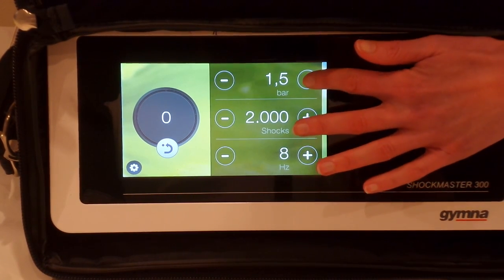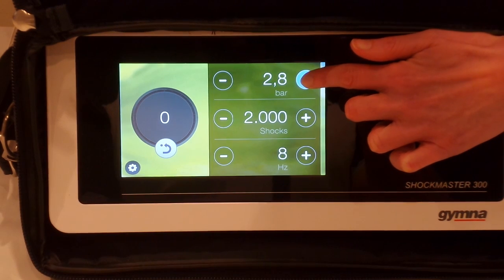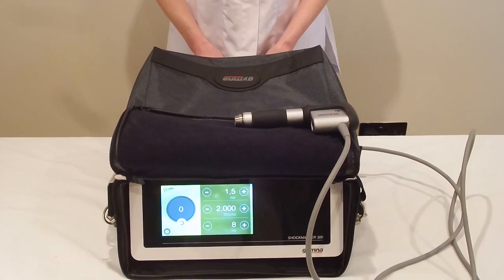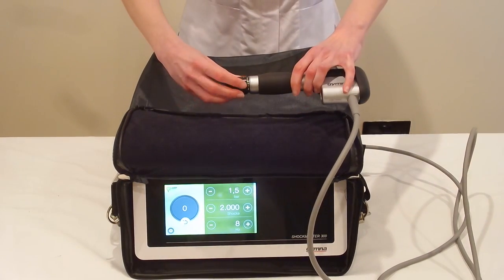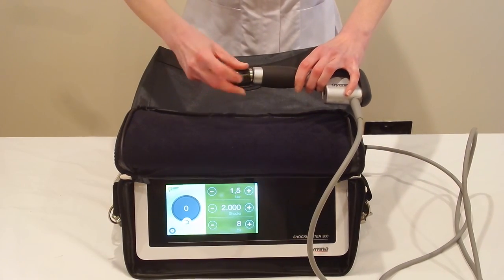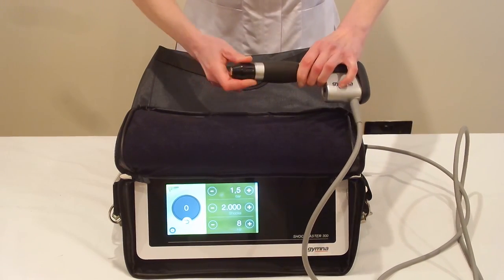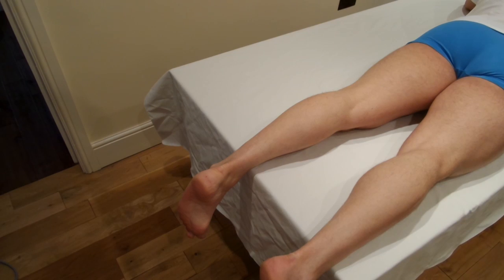Today we're treating the Achilles tendon. We'll take the power up to 3 bar and the frequency up to 10 Hertz. We're going to be using the standard 15 millimeter convex head, applied here to the Gymna Shockmaster 300, and we'll be performing this treatment as a series of spots.